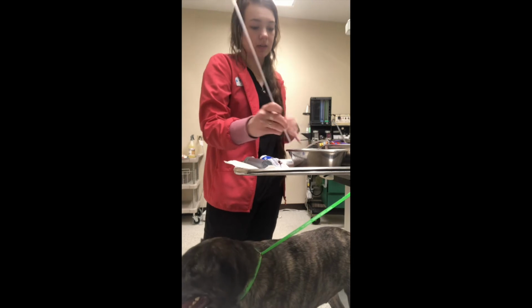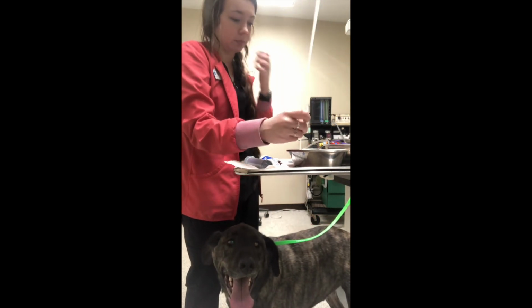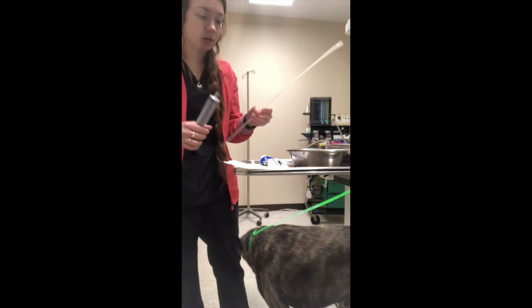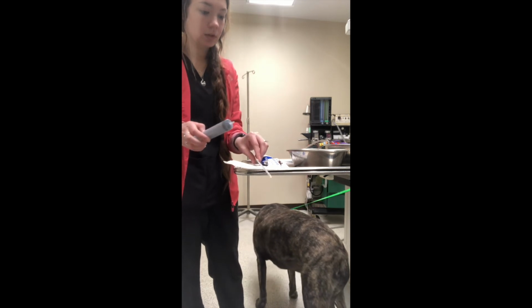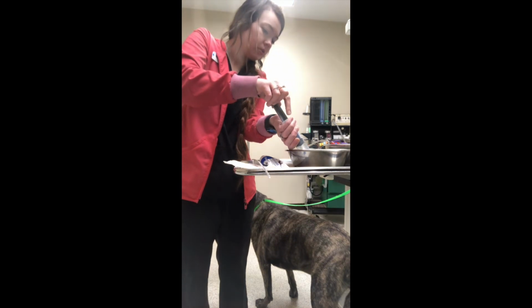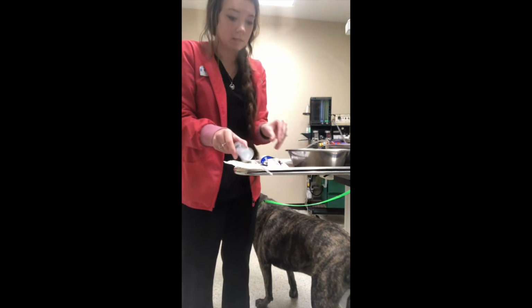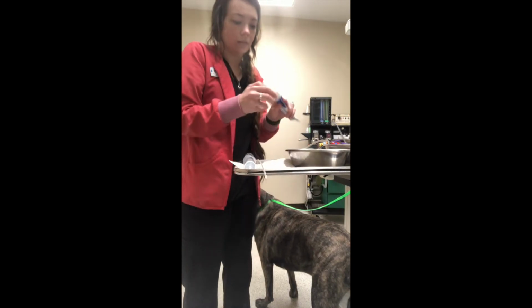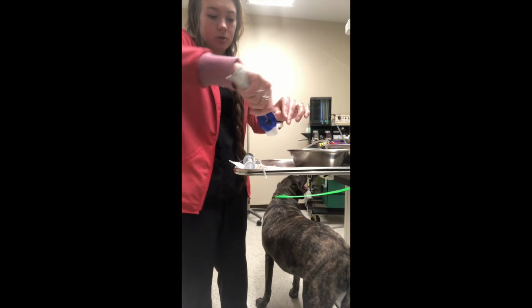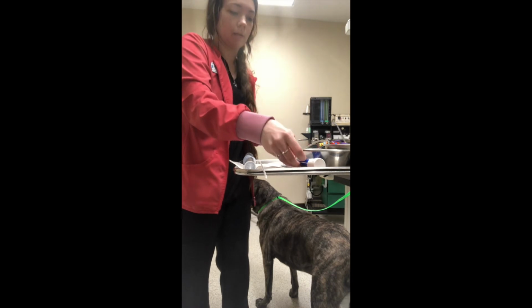And depending on the size of your patient and what the doctor wants is going to be how much enema you're going to administer. So I'm going to pull up some of my solution here in a syringe. And then I'm going to put some lube on this paper towel to use for the catheter that I'm going to use for the enema.